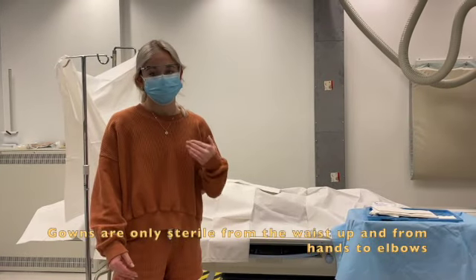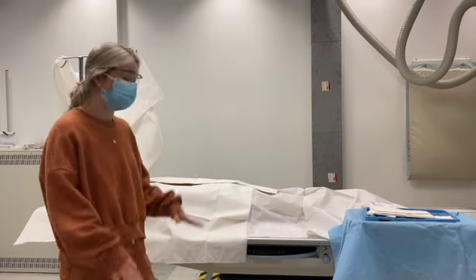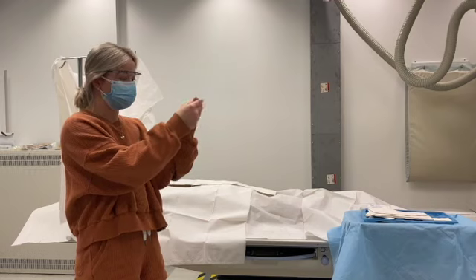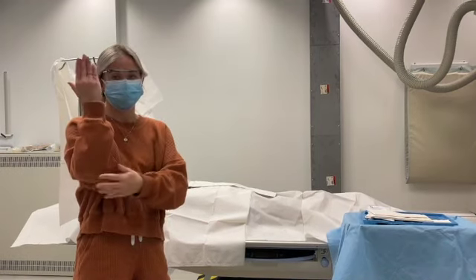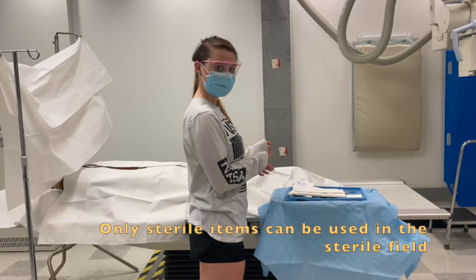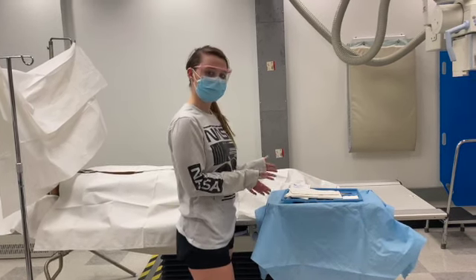When you're wearing your sterile scrubs and your sterile gowns, you want to make sure that you understand that everything below the waist is not sterile and only from your hands up to your elbows are sterile when you have your gloves on. Only sterile items can be used in the sterile field in order to maintain the cleanliness and to not cause unwanted germ spread.